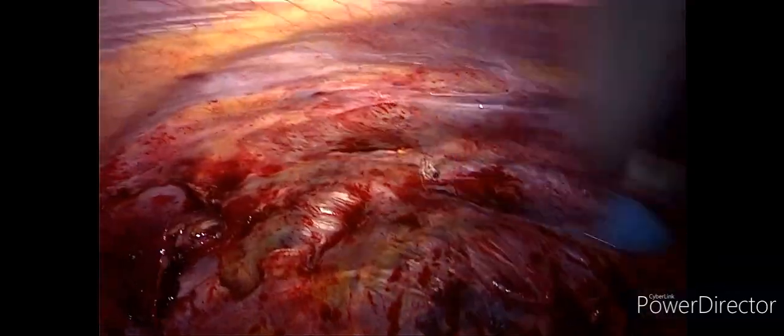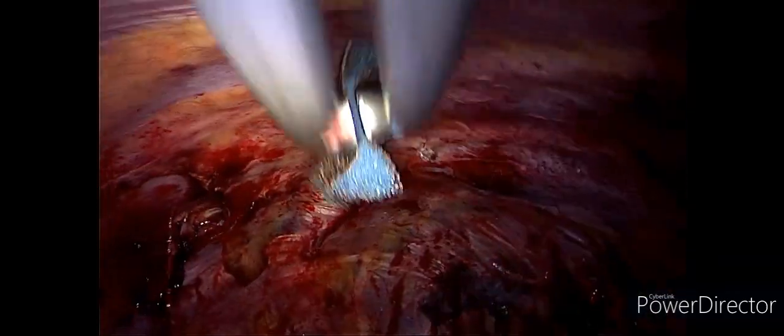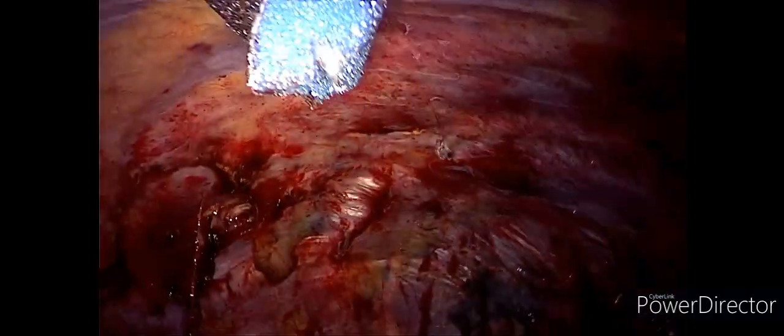Just a quick look at the chest wall. There's no extensive oozing or major bleeding, and we'll just continue our final mechanical abrasion.